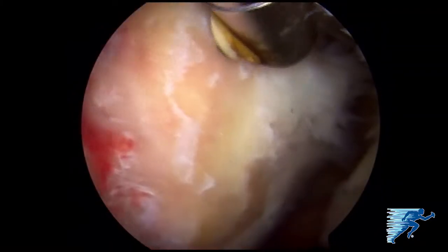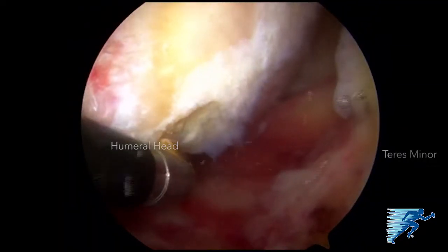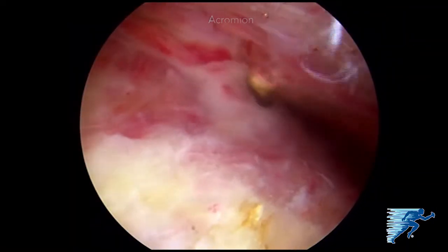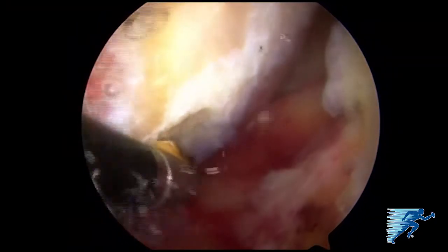Diagnostic arthroscopy reveals a massive posterior superior rotator cuff tear involving complete ruptures of the supraspinatus, infraspinatus, and teres minor tendons. Debridement with lysis of adhesions around the rotator cuff tendon is performed to mobilize the tendon. The greater tuberosity footprint is then prepared using an arthroscopic shaver to demonstrate the entire footprint.